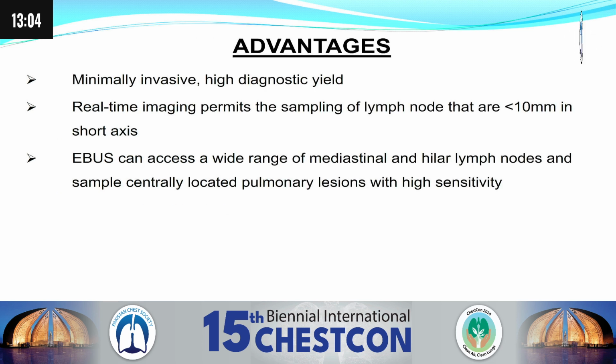It is minimally invasive and has a high diagnostic yield. It does real-time imaging, unlike the CT and PET scan. EBUS can assess a wide range of mediastinal lymph nodes. It can sample a lymph node of size even less than 10 millimeters in short axis.